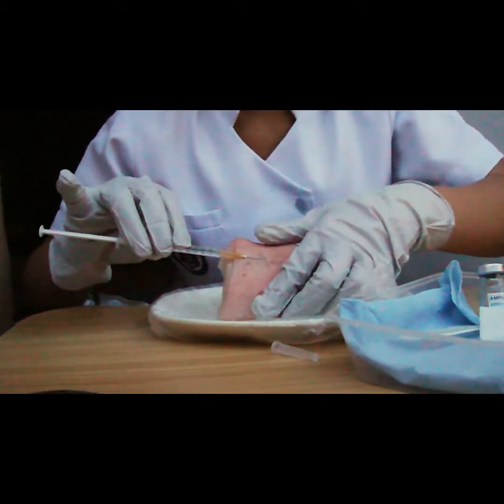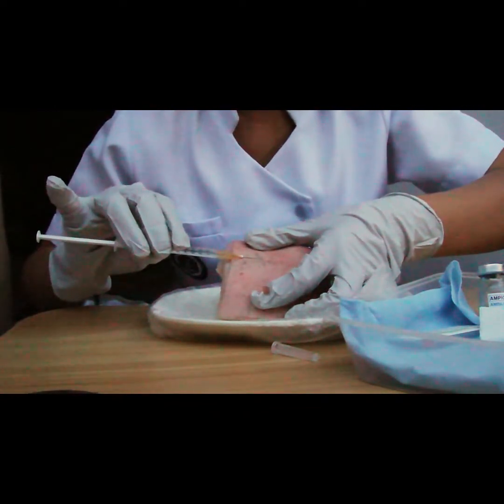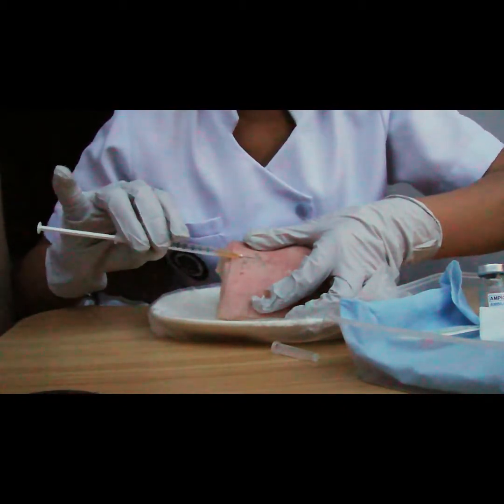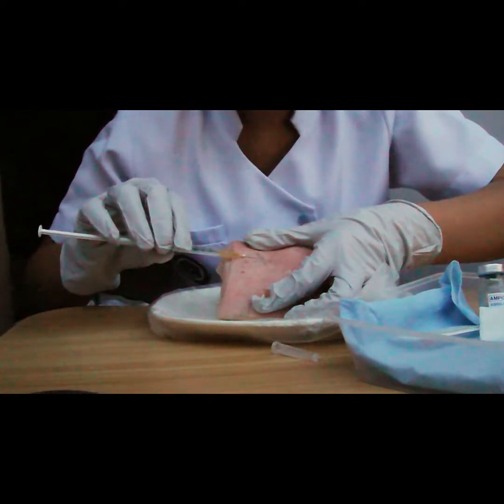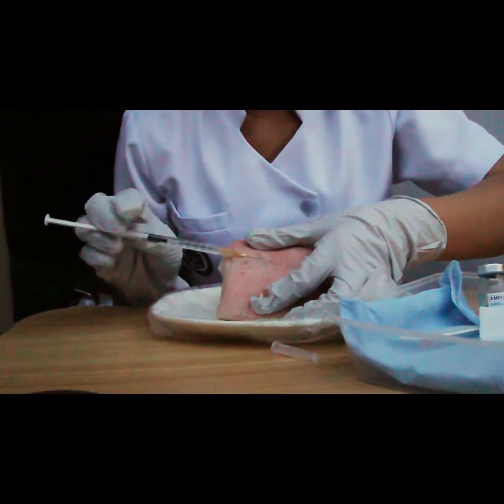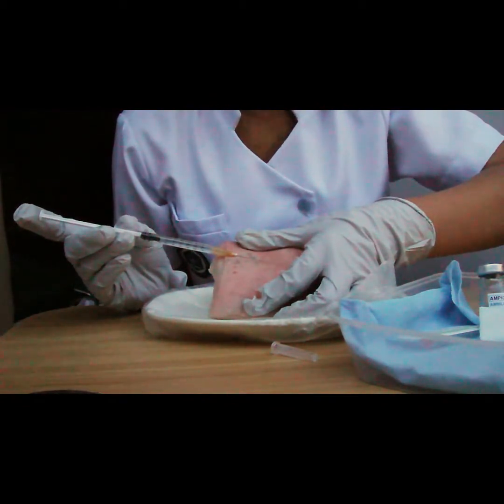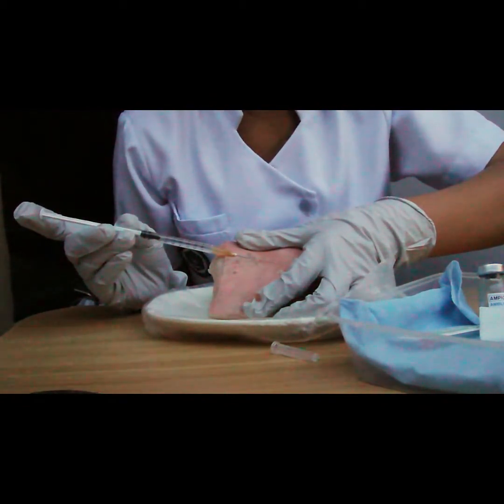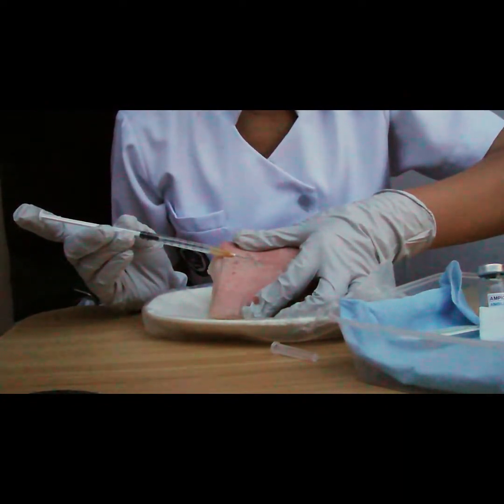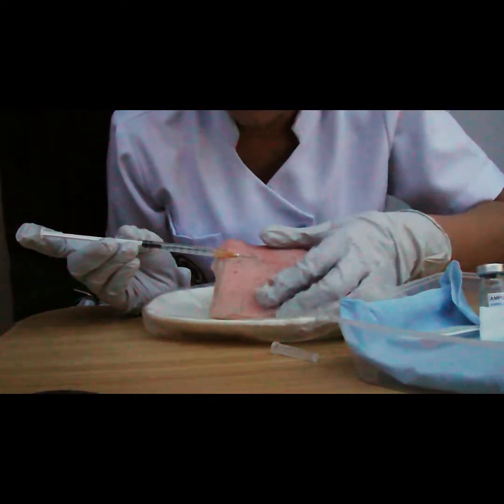With the non-dominant hand, pull the skin at the site until it is taut. Taut skin allows for easier entry of the needle and less discomfort. Insert the tip of the needle far enough to place the bevel through the epidermis into the dermis, 10 to 15 degrees. The outline of the bevel should be visible under the skin surface. So, kailangan visible siya sa skin surface.